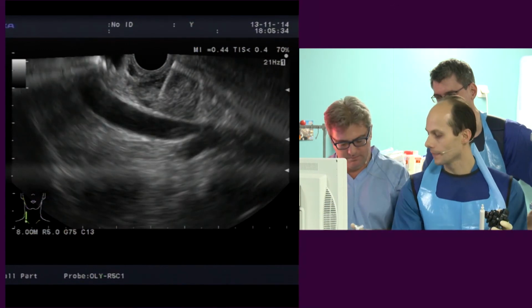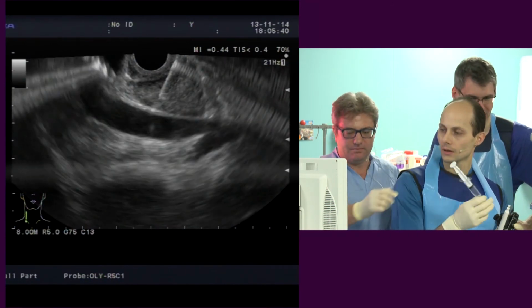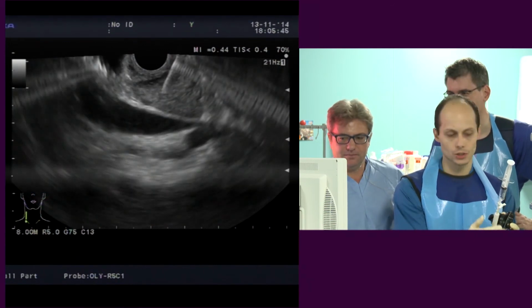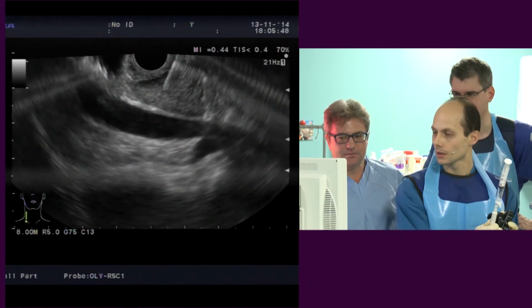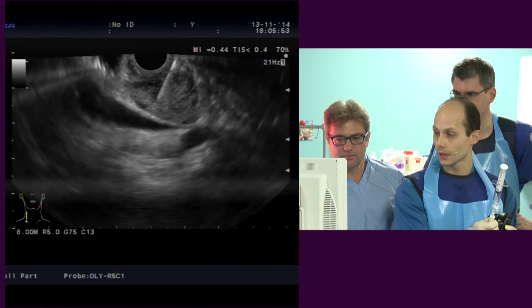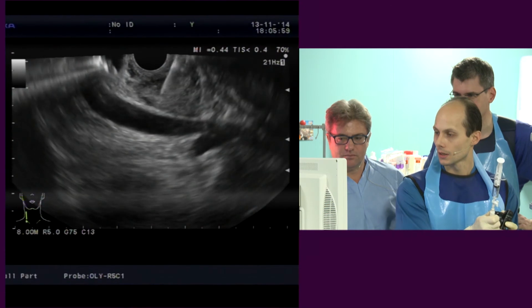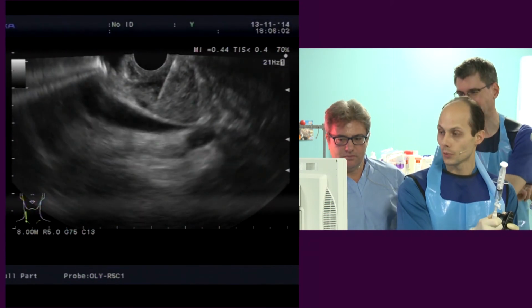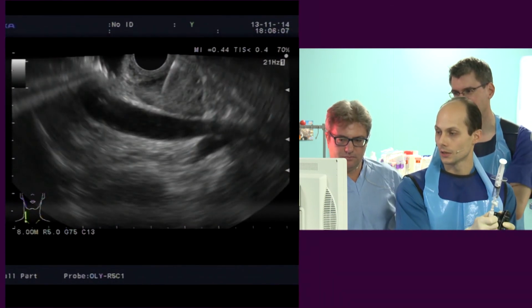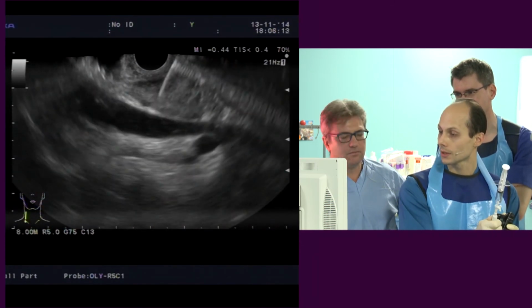What does it mean that it's so dense? Is it the result of chronic inflammation, or are there some suspicions? Well, without suspicions, we would not do such a diagnostic search. But of course it could be an inflamed node, and it could be that dense. As to the ultrasound features, it is just inflammation. It is really a truly inflammatory node.